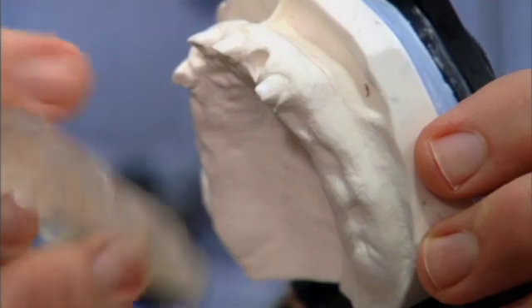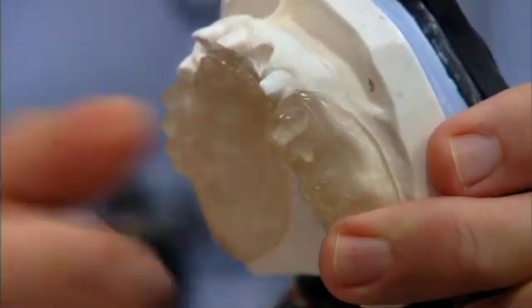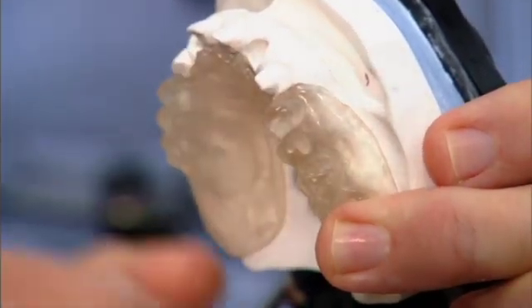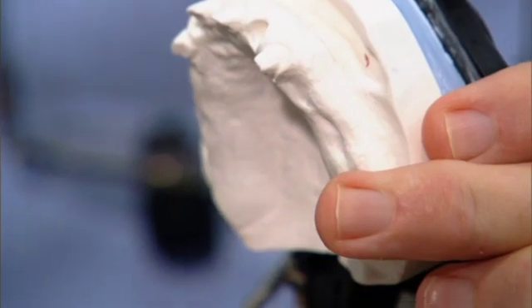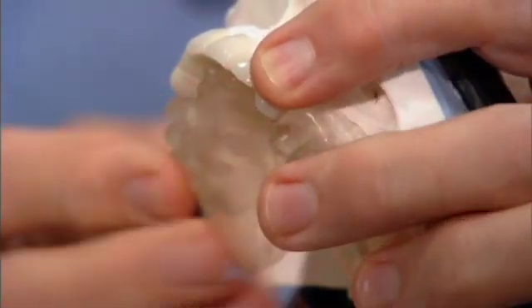We've also fabricated a clear stent that fits in Beverly's mouth to help us direct the position of our implants. With her provisional bridge in, our clear stent will serve as a guide for implant placement.